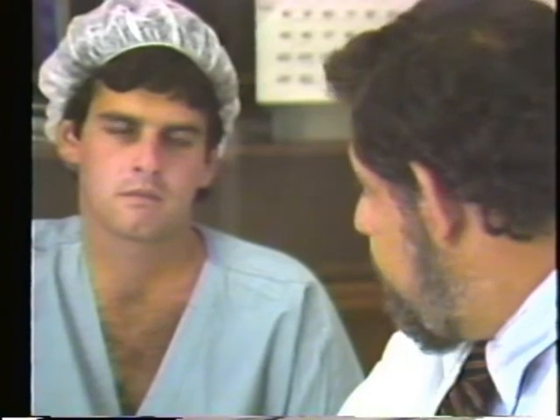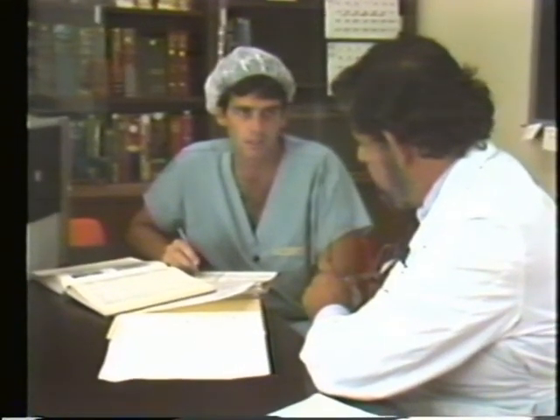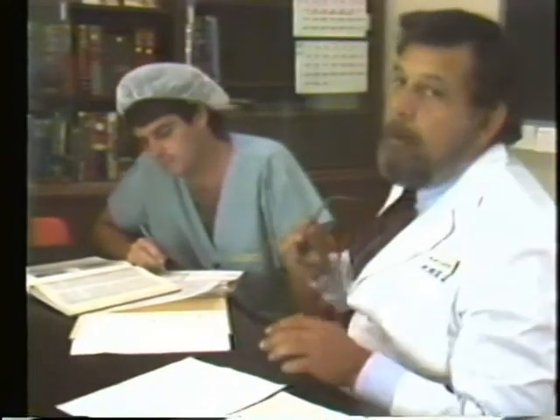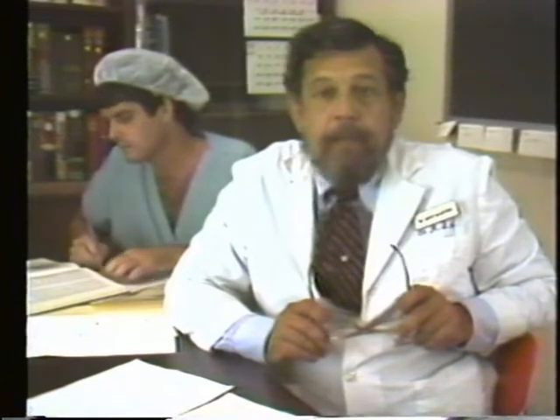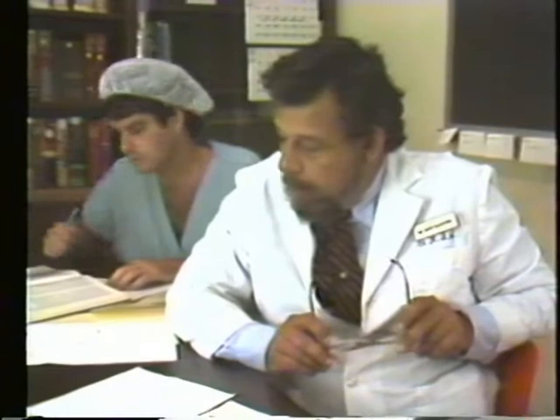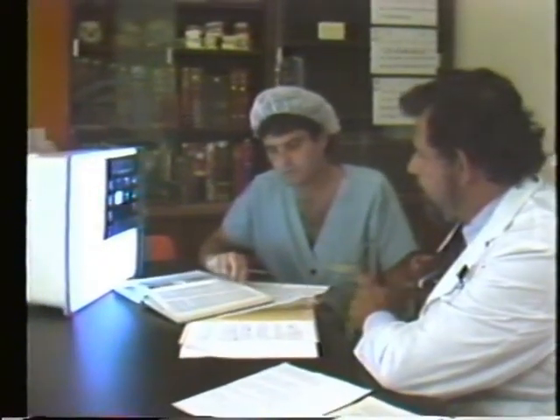State the patient's name, age, sex, and chief complaint. The patient's name is Mrs. Nancy Spencer. She's 26 years old, Caucasian female. She presents today with pain in the right mandible. Next, briefly review the history of the chief complaint, the past medical history. Describe any exceptional physical findings, both systemic and oral. Finally, describe the findings from the radiographic examination.